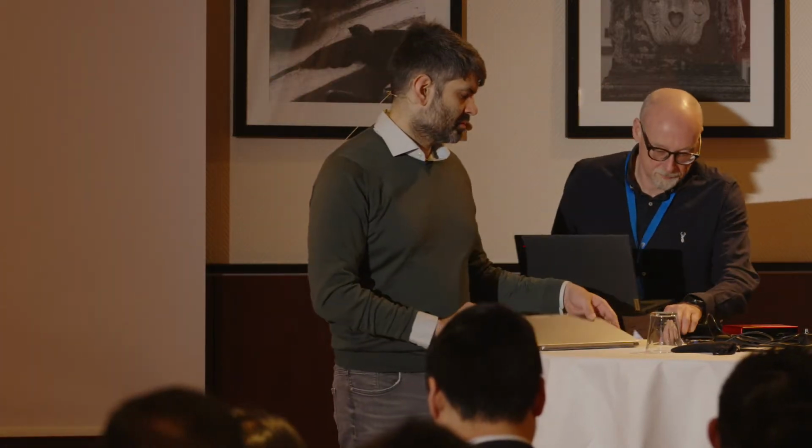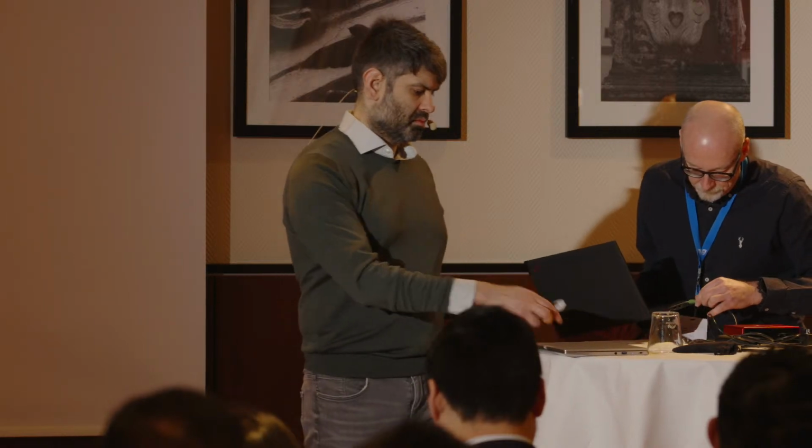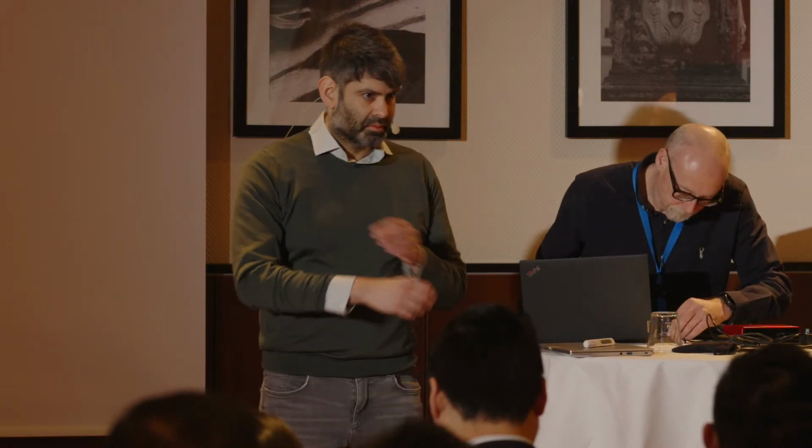Rather than the angiography. But likewise, certainly up in the iliacs, in even the aorta, if I've got the lumen gain that we were intending, actually that's changed my decision, and I've then gone on to make the decision not to stent on the basis of the lumen gain I see on the IVUS. But then again, there's another feed into that decision making, right?